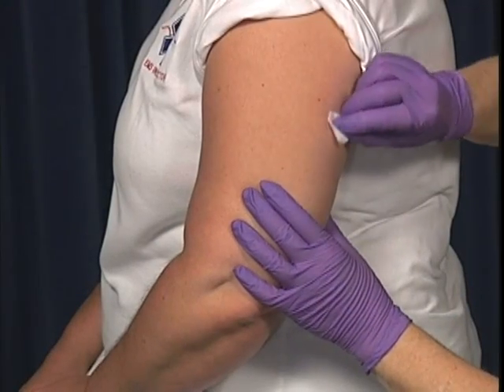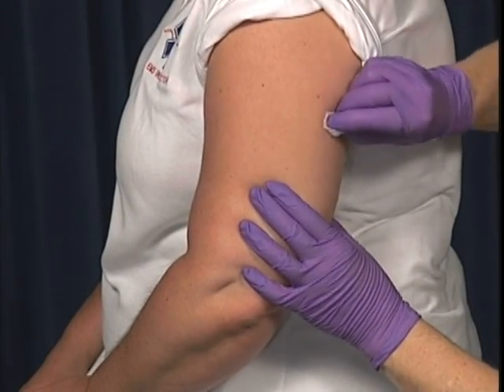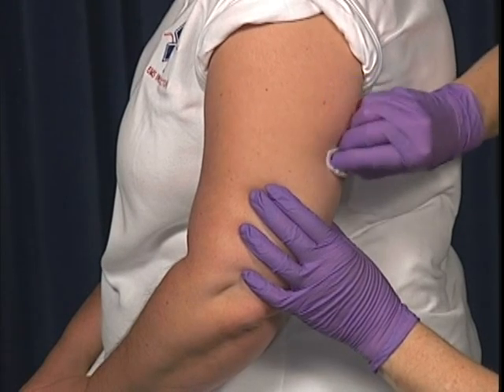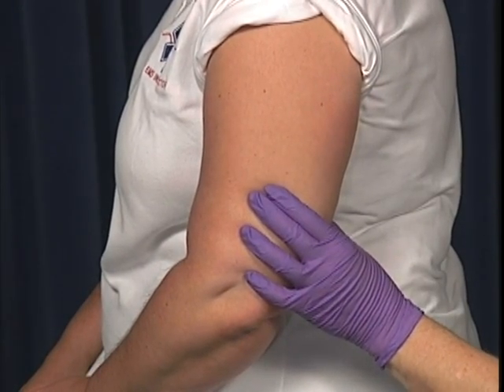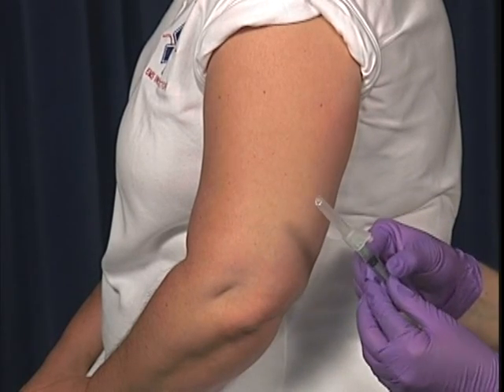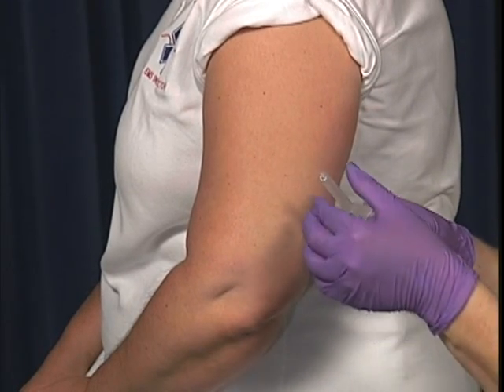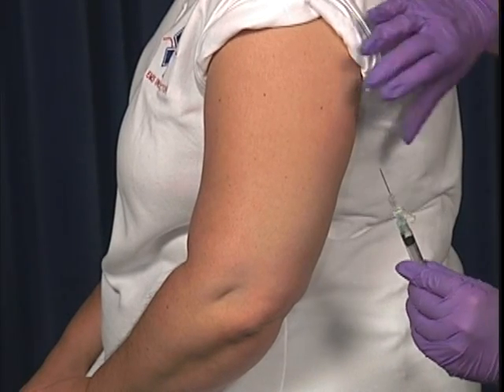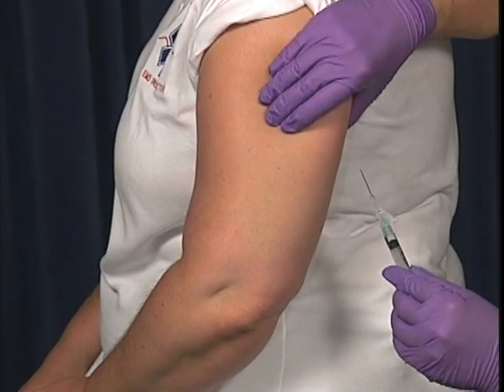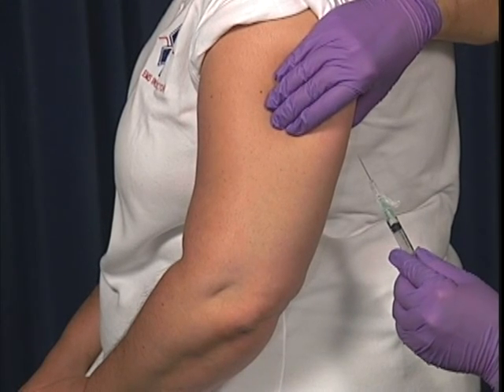When administering a subcutaneous injection, always cleanse the injection site with an alcohol prep or other suitable antiseptic swab. Allow the swab spot to dry for approximately 30 seconds. Hold the syringe in your dominant hand and remove the needle cover. Stabilize the injection site with your non-dominant hand using the pinch technique.